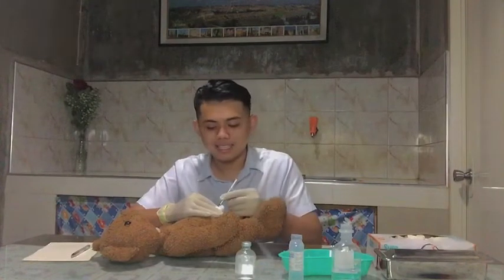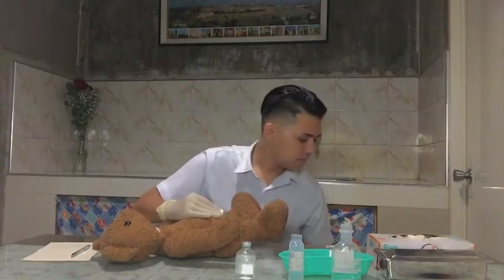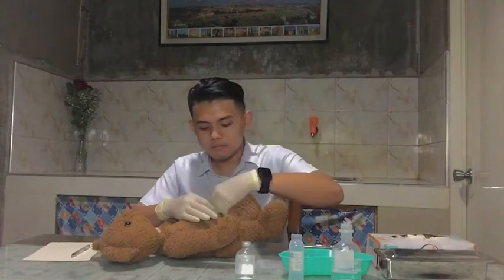Now remove the needle smoothly, pulling along the line of the insertion while depressing the skin with your non-dominant hand. It minimizes the patient's discomfort when the needle is withdrawn. If bleeding occurs, apply pressure to the site with dry sterile gauze until it stops. Discard in the receptacle.